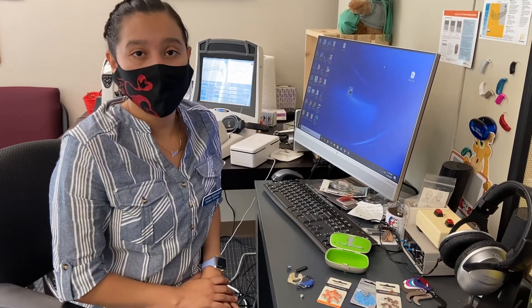Hi, I'm Jasmine from California State University of Northridge Audiology Program, second year doctoral student. I'll be conducting a video on how to change your batteries for your hearing aids.